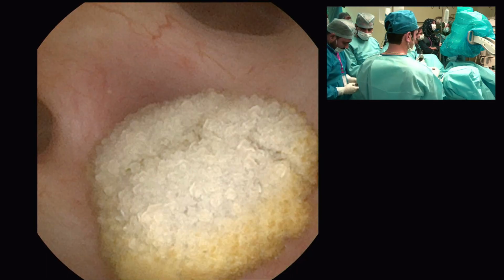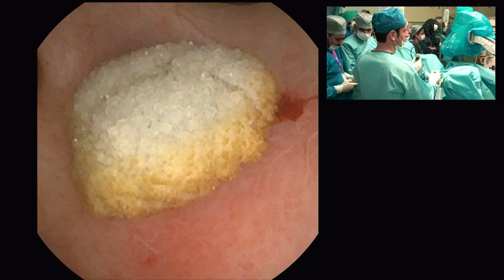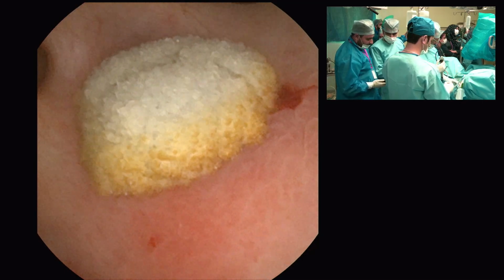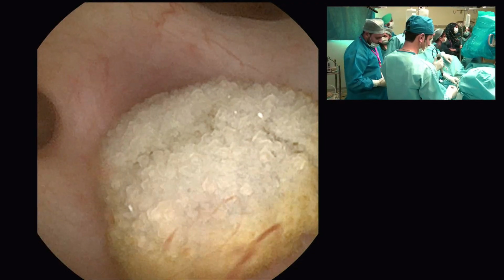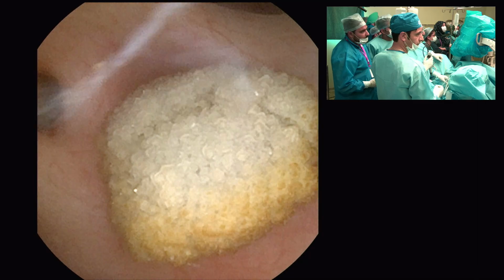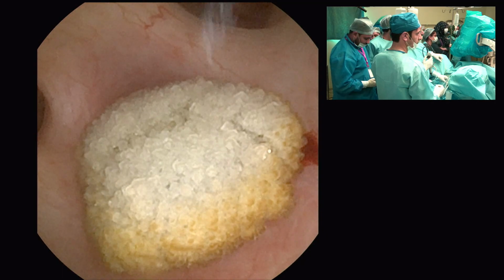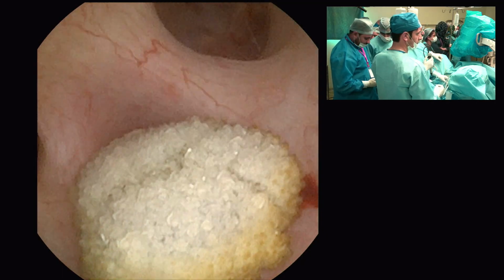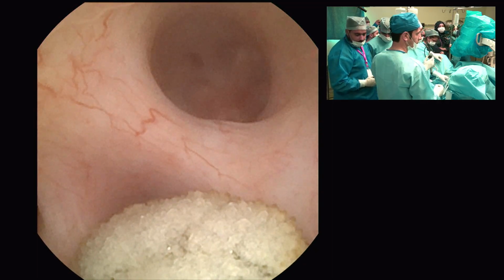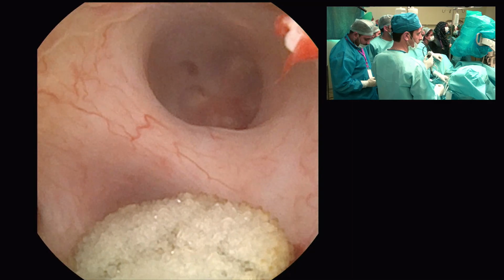So, only 1 minute, Dr. Sajad. Okay, sir. So this RIRS is nothing but an extension of URS. Anybody who knows how to do a URS or who has good hand-eye coordination in the optics of the lower tract can excel in this. Now you see the difference. You are using a natural orifice, a natural passage. But this has only been possible because of the miniaturization of the equipment, the digitalization, and the techniques that have come in the last decade or so. So you can see how RIRS is now taking care of stones right in the upper tract, which was not thought of 10-15 years back.